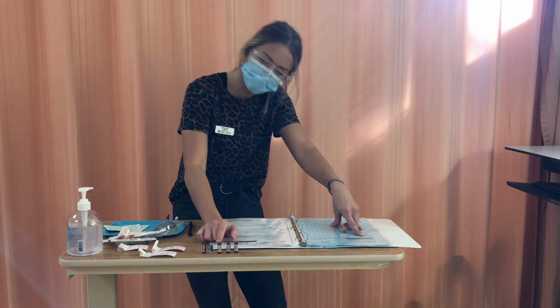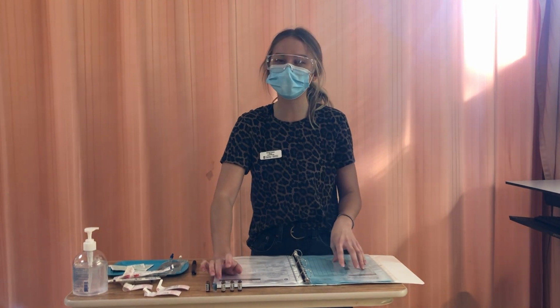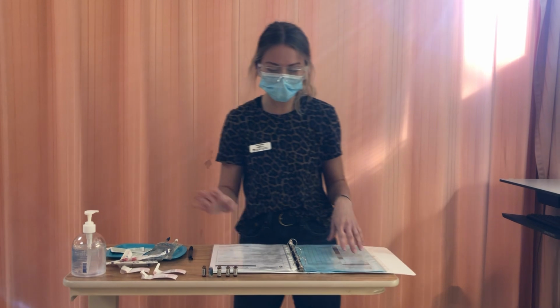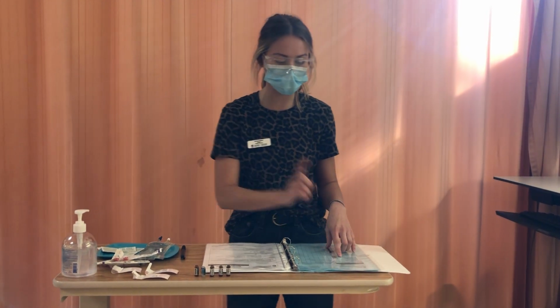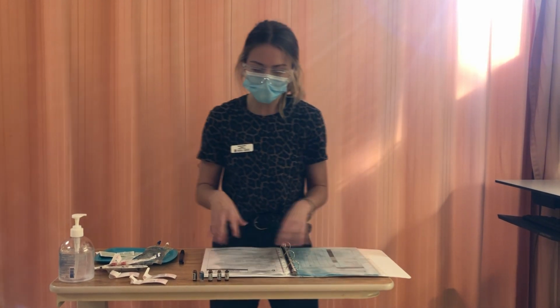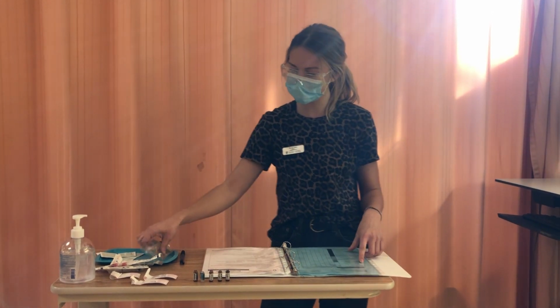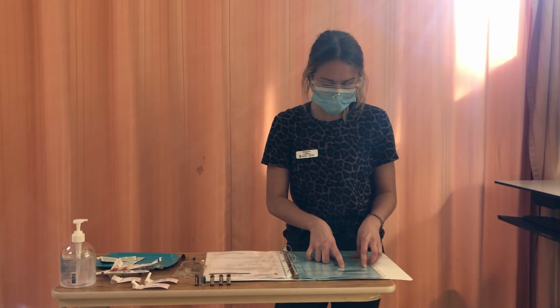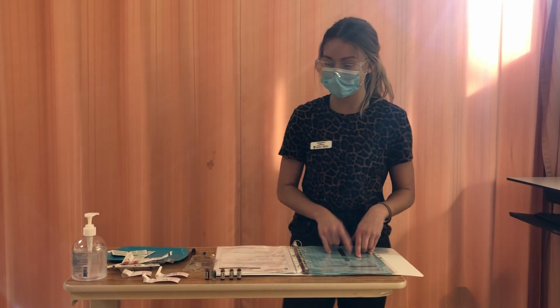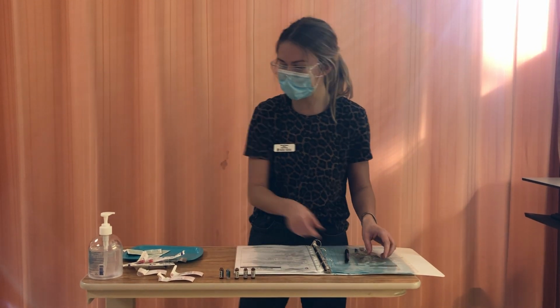This is 10 milligrams per ml, but I will be taking 1 ml from each one, and diluting it into my 45 ml bag of normal saline. So that will give me a final concentration of 1 milligram per ml, which is what the doctor ordered. So that's the right dose. The right route is PCA. I have my PCA MAR here, and I verified according to the monograph that I can do a PCA, and this is an IV medication. And I have my bag here that I'm putting it into. The right time to be given is now, and the lockout interval is 5 minutes that I will make sure I note on. So that looks good. Next, I'm going to draw up my 5 mLs.